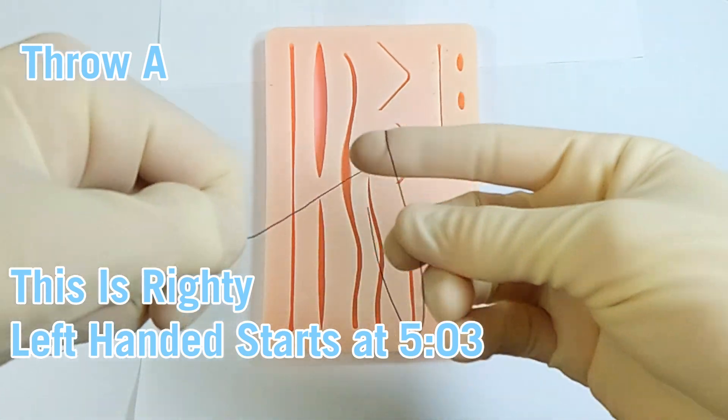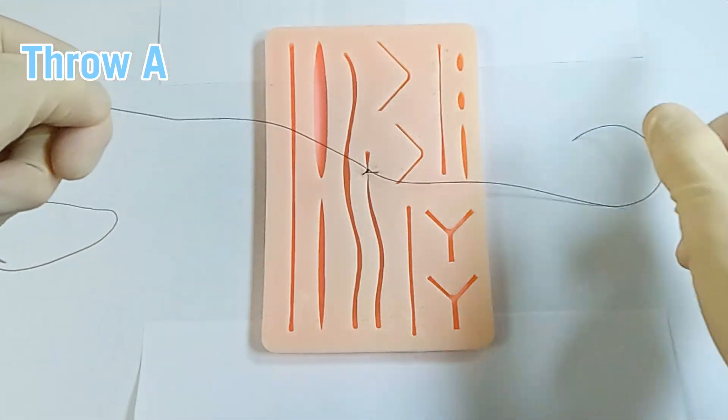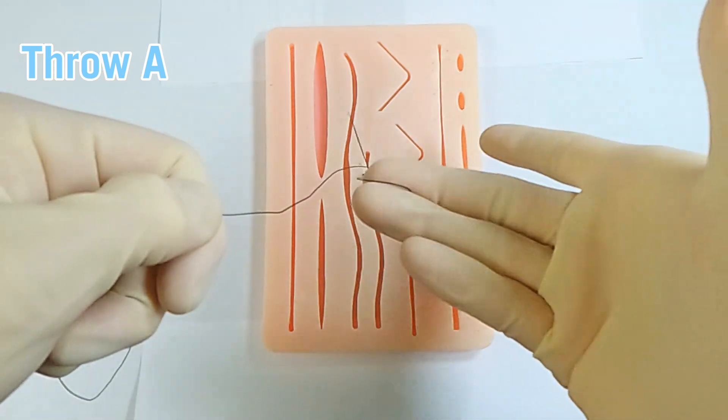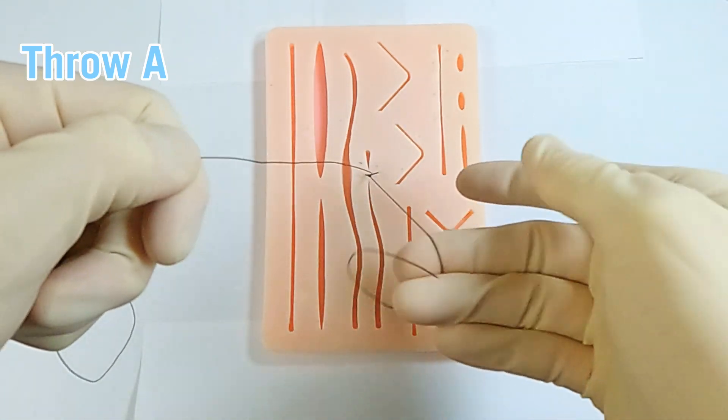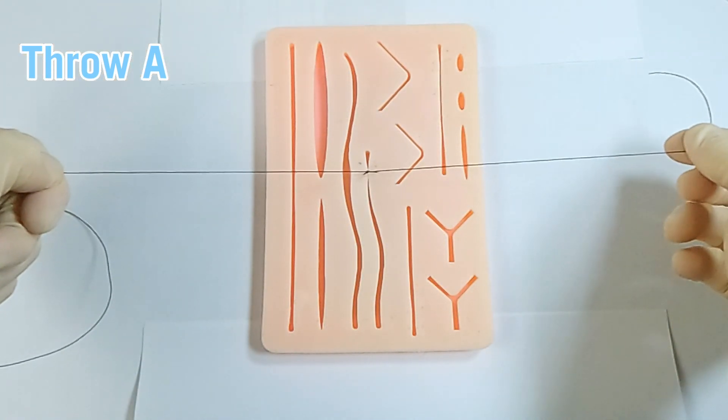Here's a different variation where I don't move my thumb initially — I just go all index finger going under, over, flex, over, and through. And here's another slight variation where I'm pinching between my middle finger and ring finger, which gives me a little bit more space to work that index finger.